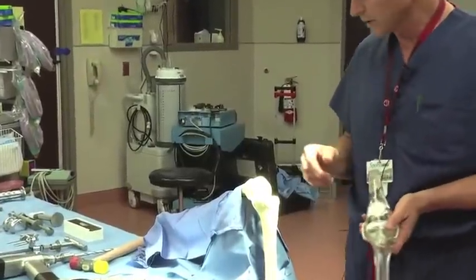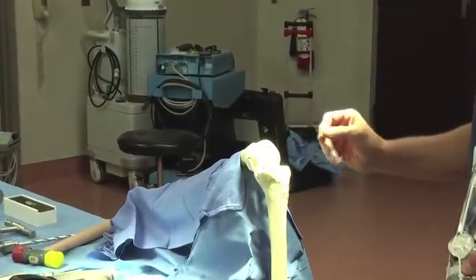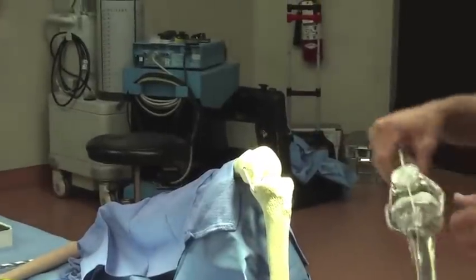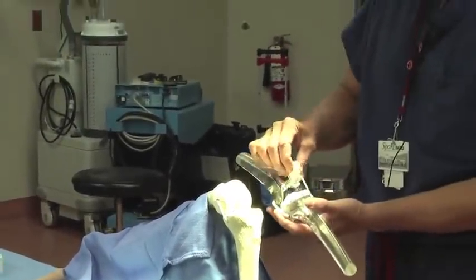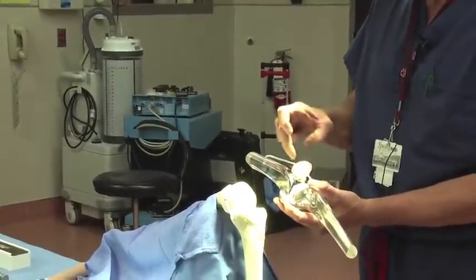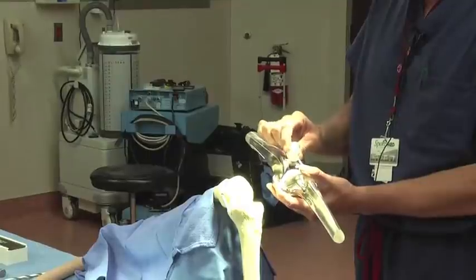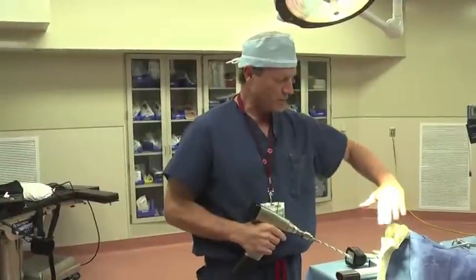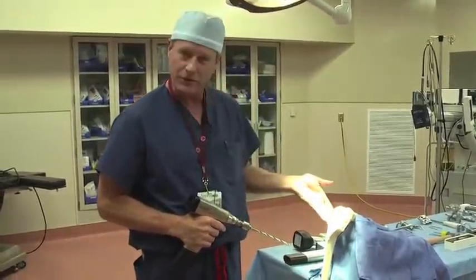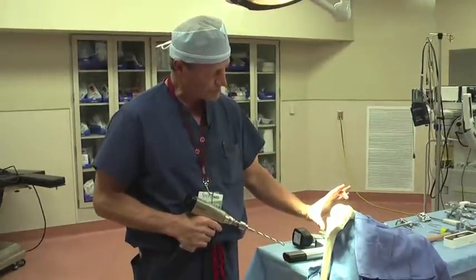When we first make our incision, we make a skin incision directly in the front of the knee, and then we go inside and we actually rotate out the kneecap to where we can get to it. On this model, we'll rotate the kneecap out right here, and then we take off the spurs, or what we call the osteophytes, and make a cut where we make it flat on the patella and then put a plastic button on. Once we've prepared the patella, we evert it out and we have a retractor that holds that out of the way and a retractor from the inner side that holds the soft tissue, giving us good access to the knee through a limited incision.